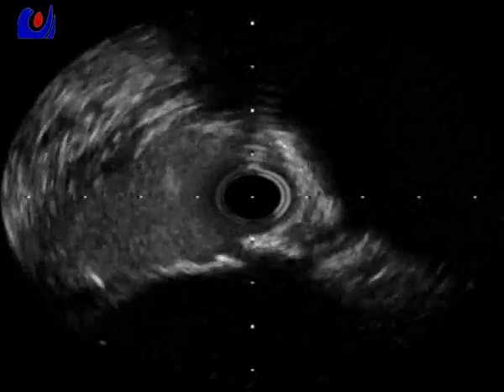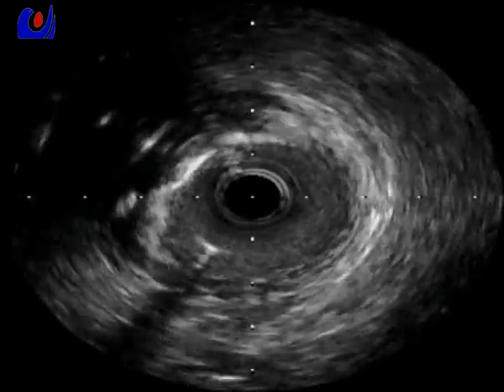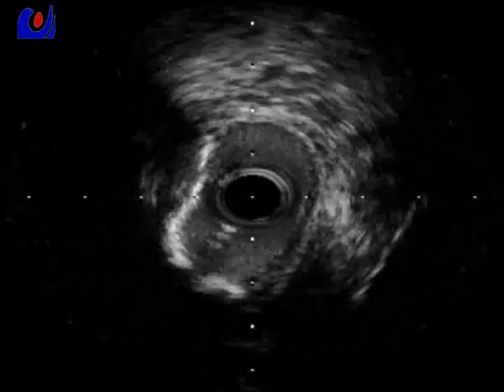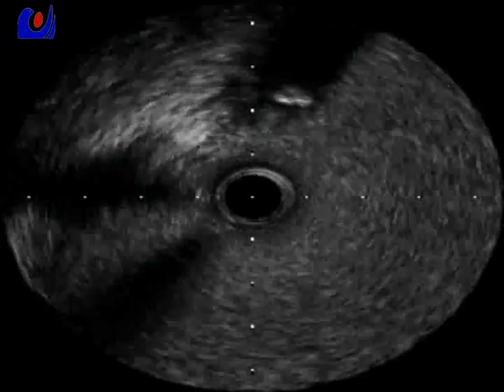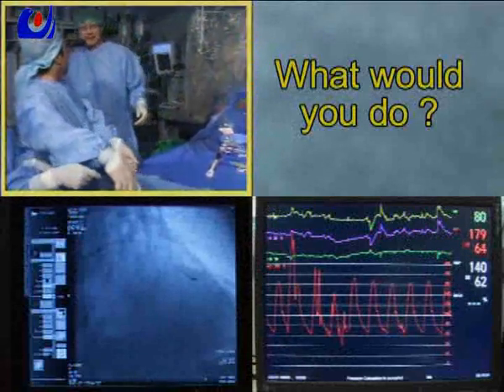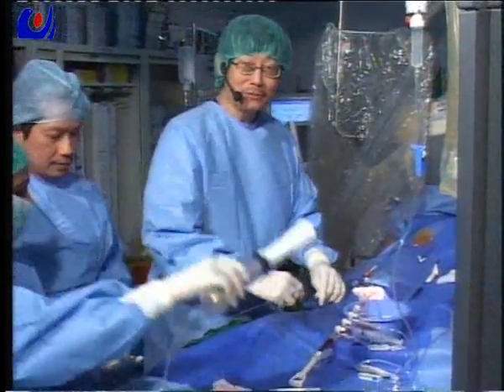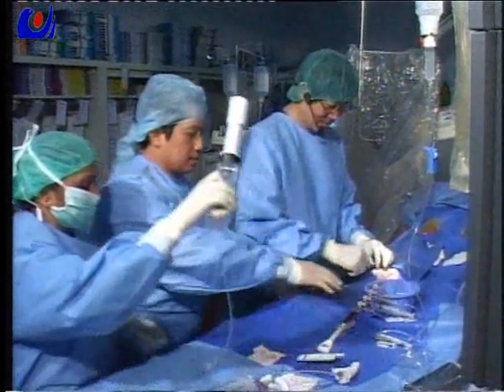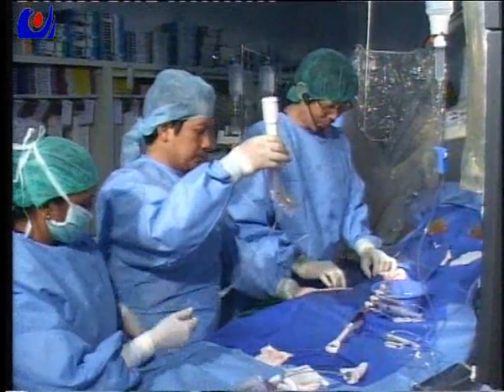So you can see this left main. We can calculate. Maybe Hisham can help me calculate that distal left main. Hisham, would you like to comment on the calcium score? Yes, left main is whole. So what about the minimum luminal area for the distal left main? You calculated? 5.1. So yes, it deserves to be treated.